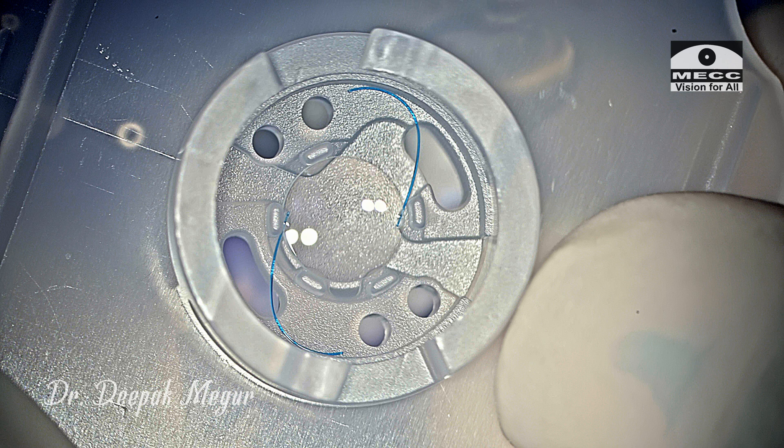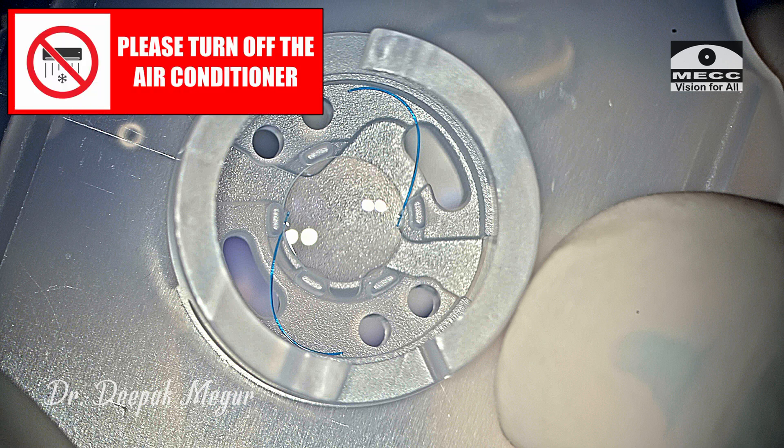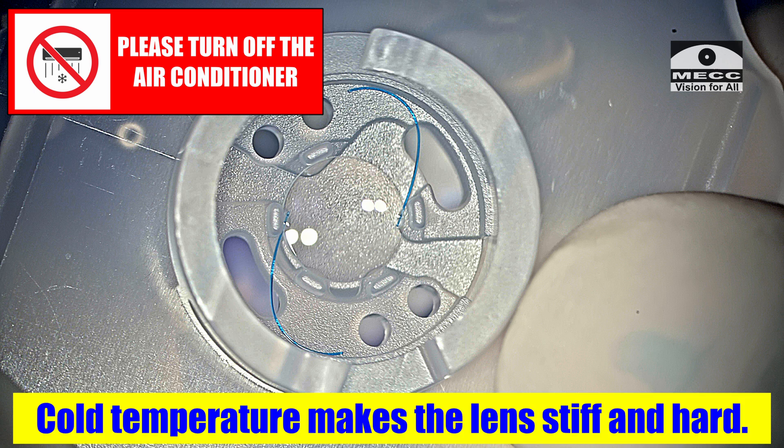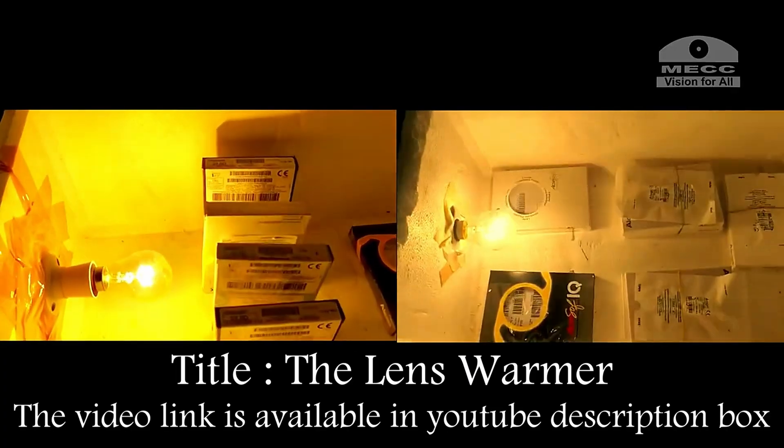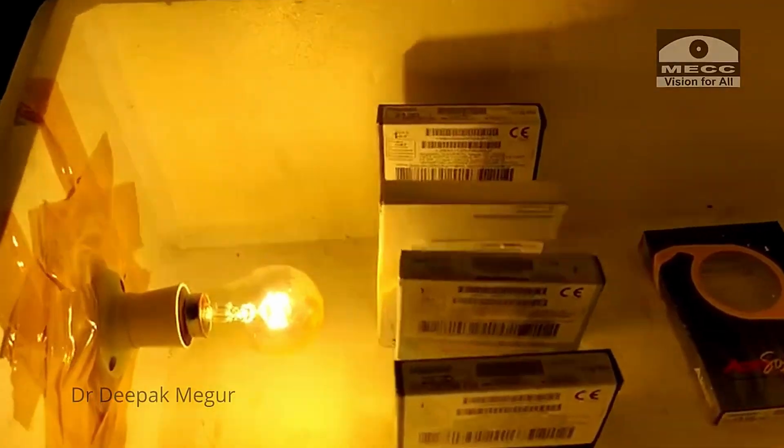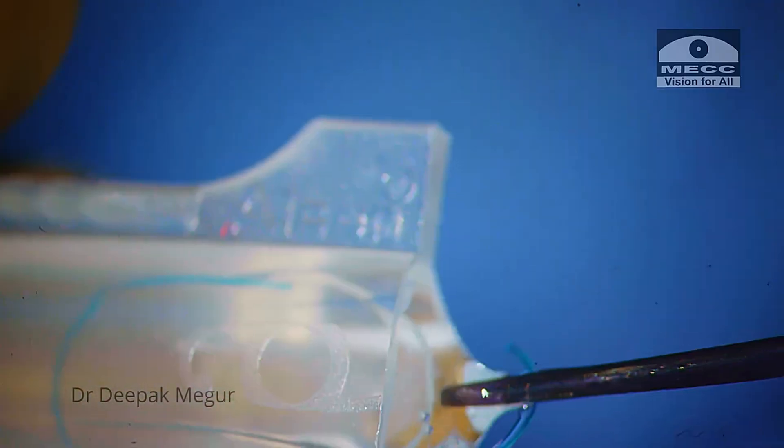An important point to highlight: I prefer to always turn off the air conditioner when loading hydrophobic lenses. Cold temperature makes these lenses very stiff and hard, which makes them problematic to handle. Keeping them a little bit warm is definitely beneficial and helps in both loading and implanting.